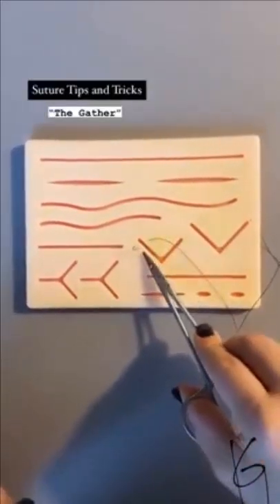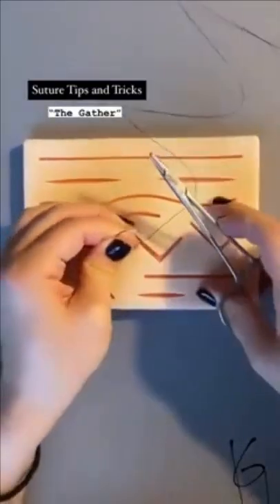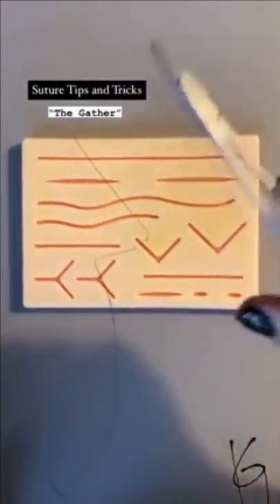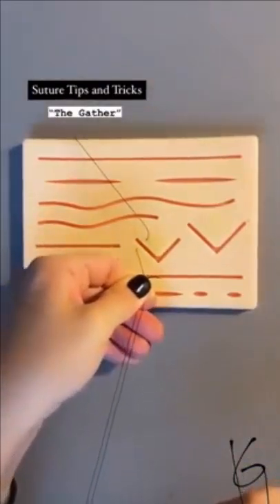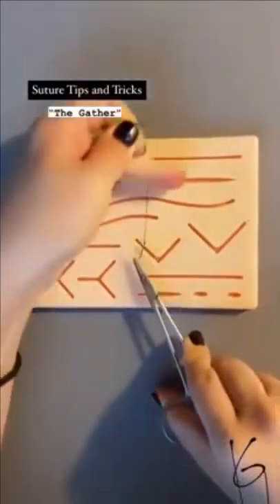Quick tutorial on how to gather: once you're through the first and second part of the skin, you pull the needle, pinch, and hold it in a safe position. You pull. Now, with all this extra suture, you take your needle driver, push down towards your wrist, pinch the suture with your two fingers that are holding the needle, and you grab and pull. You just gathered in one step.